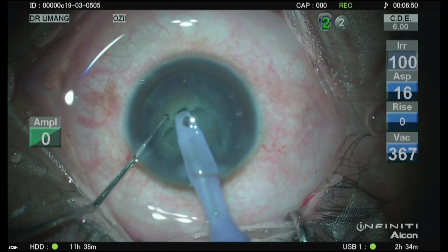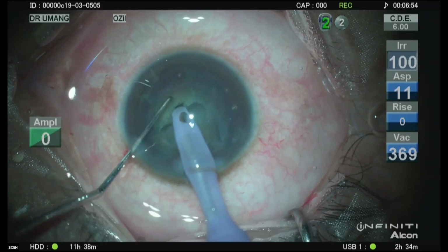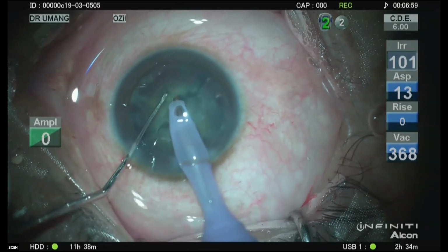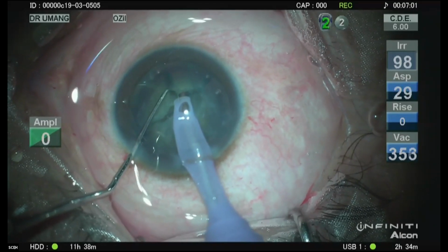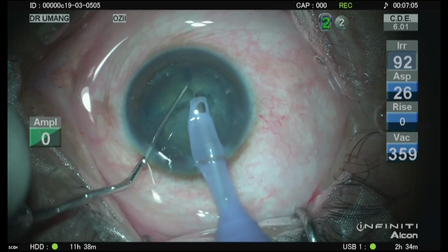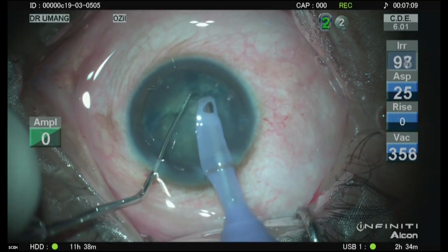Now I'm in step 2 only. I'm not in step 3. I'm holding and I press down and I get a little crack. But I've not got all the way. I keep holding into the crack at another level. I'm still not completely cracked.